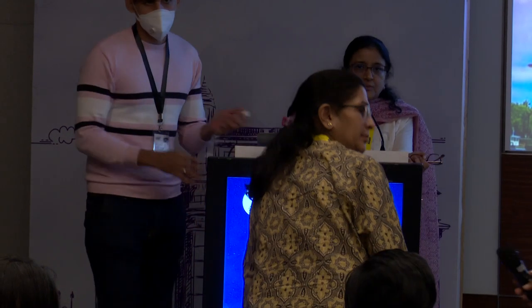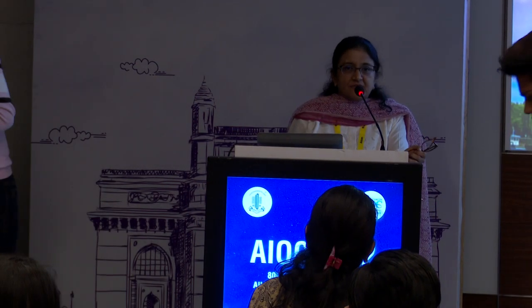So if I get your question right, what you are saying is, when do we go ahead for a vitrectomy and when do we take a vitreous sample? Yeah, definitely. In today's time where we are having MIVS, once we go inside, we are not really taking an aspirate of the vitreous because that is causing an unnecessary traction. What we are doing is we are using either a 25 gauge or a 27 gauge cutter. And once we go inside, in a case of endophthalmitis, we would collect the sample and do a core vitrectomy along with it.